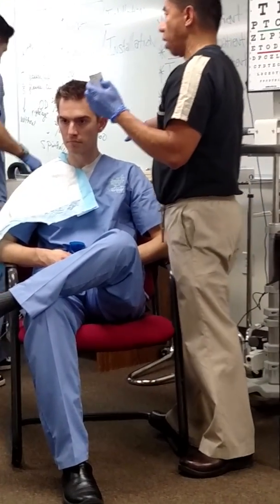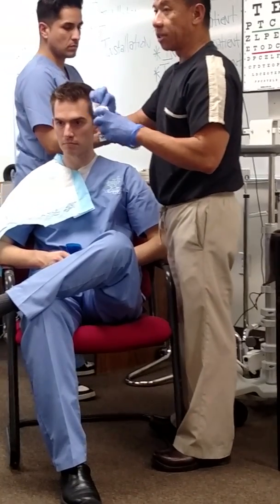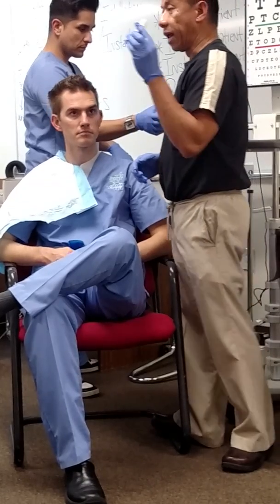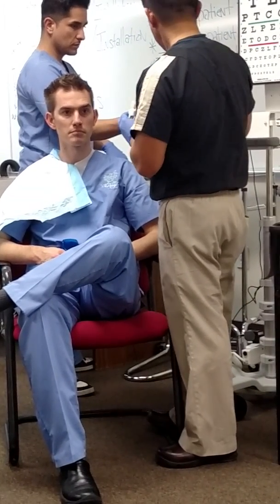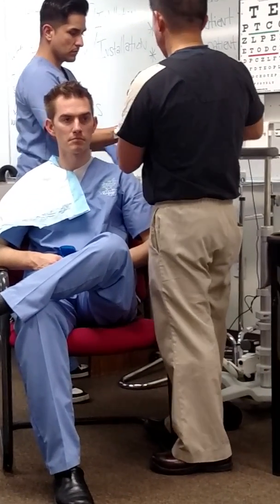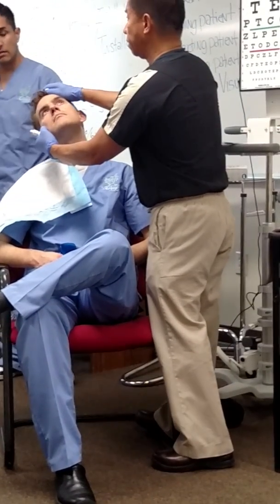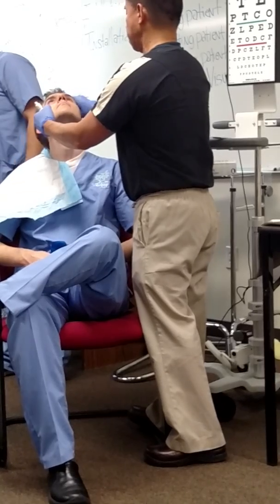I need a cotton ball. So again, based on the doctor's order, how many drops? Same thing. You will label once you open it. And pretty much the same thing with the medication, but now you have to look up. You're not going to have them lean towards the injured eye. Just stay center. Okay.